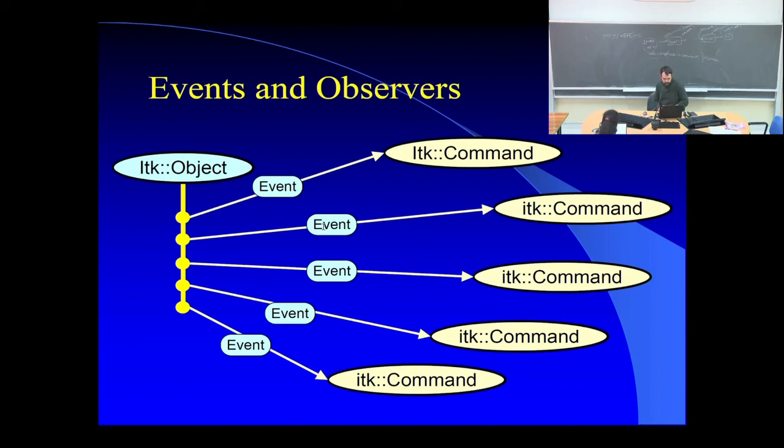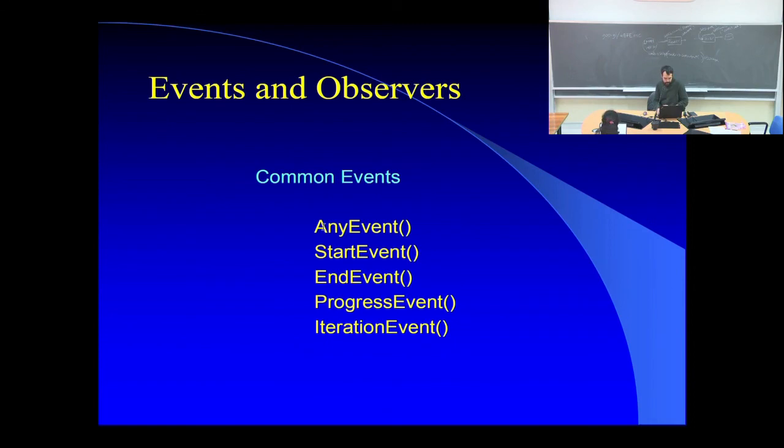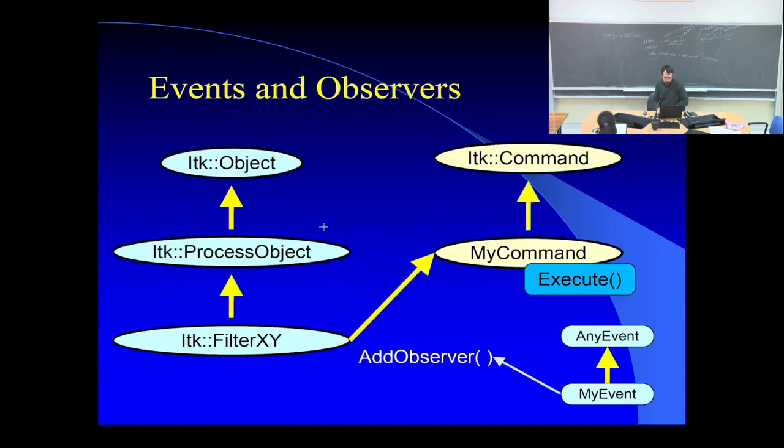And you can have events, and this is very powerful to link to a GUI, a graphical interface. You click a button, then you communicate with your ITK source code, etc. Again, these are advanced things, but I think it's good to know that it's not only applying filters. So you can have event-driven applications as well.